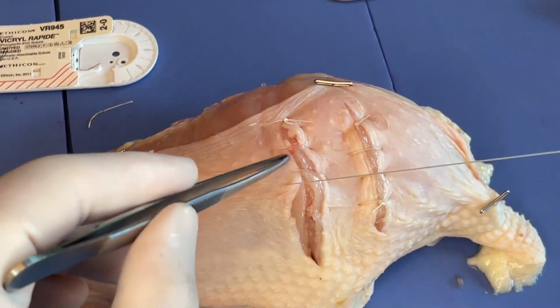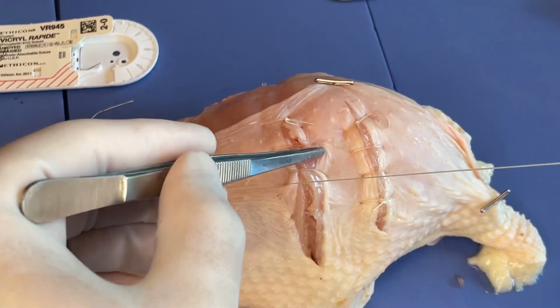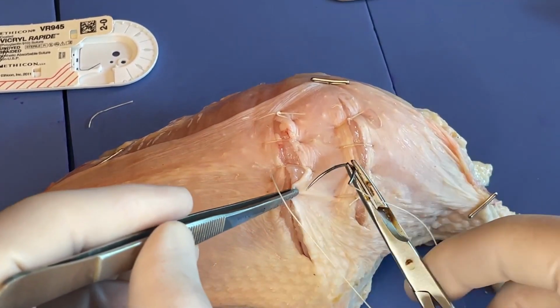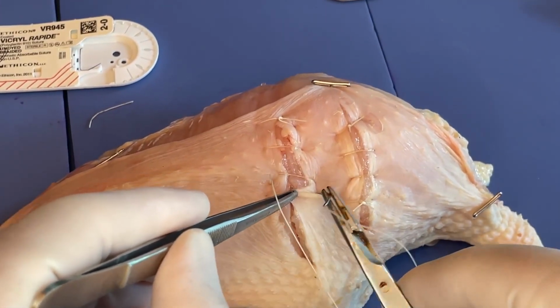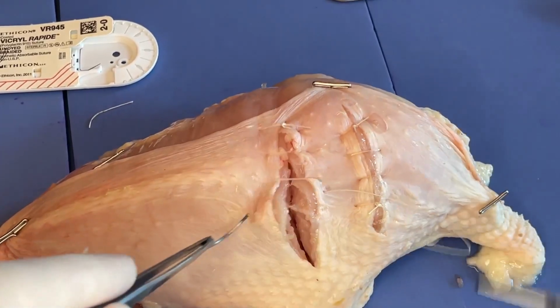Now, you can see here that the skin edge on the left is really tucked up right against the edge of our incision. The skin edge on the right here is kind of falling off to the side, so we have what looks like a little bit of a gap. So if I wanted to correct that, I could really grab the skin edge itself to make sure that I'm incorporating that into my bite. So now, as I come across here, hopefully that will get that right skin edge a little bit closer.